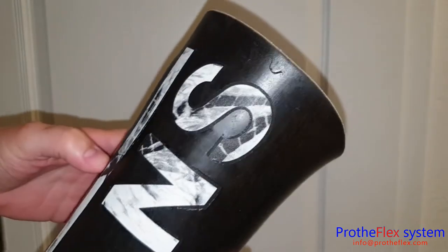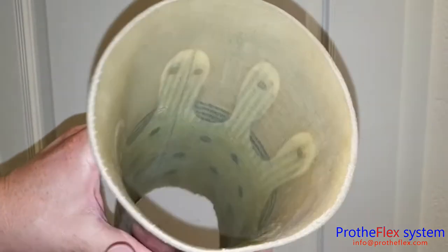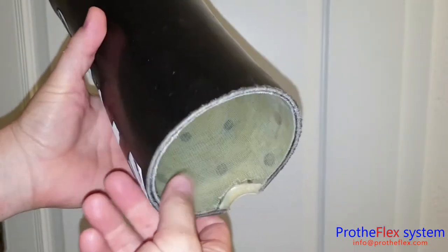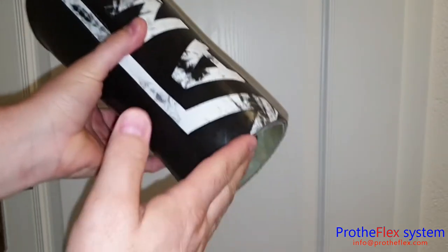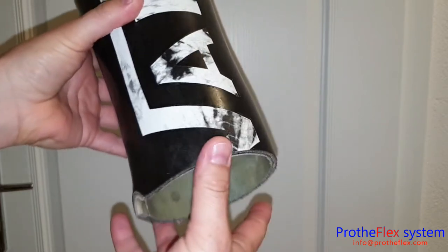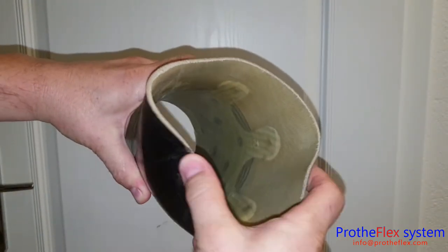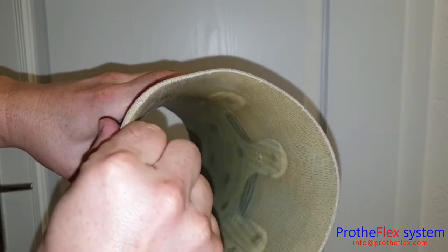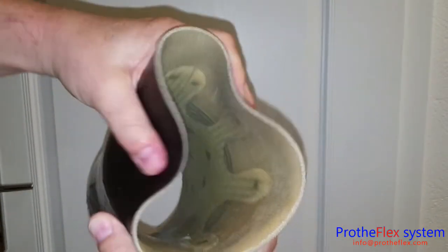This socket was used for one and a half years — it was made by German technicians. I got this part without the distal end and without the adapter, just to examine it, and it's still like new. The elasticity is still there, the flexibility — it works perfectly.